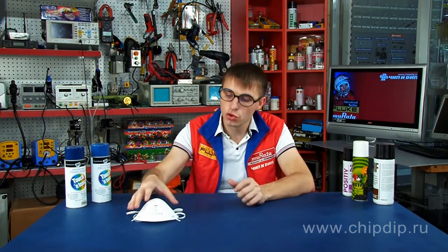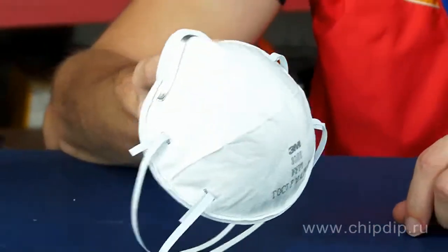Let's look at one of the respirator models offered by 3M. This product is made as a filtering half-mask, manufactured using hypoallergenic materials.